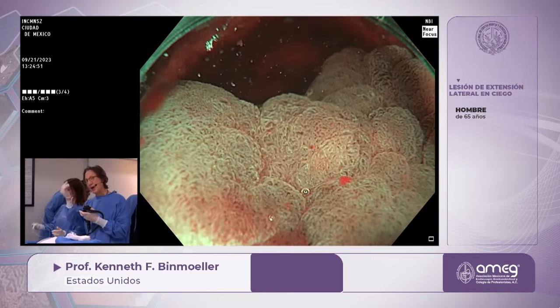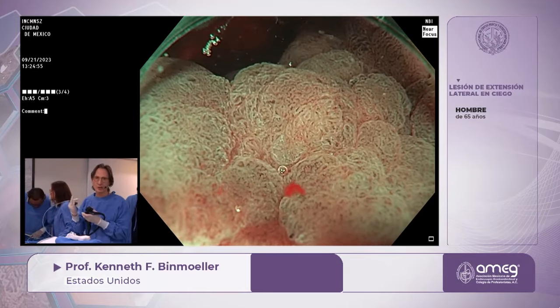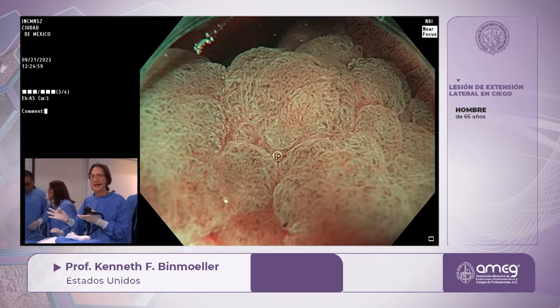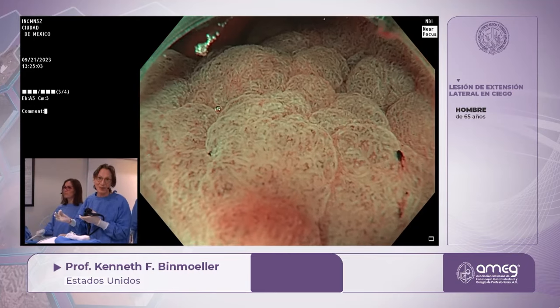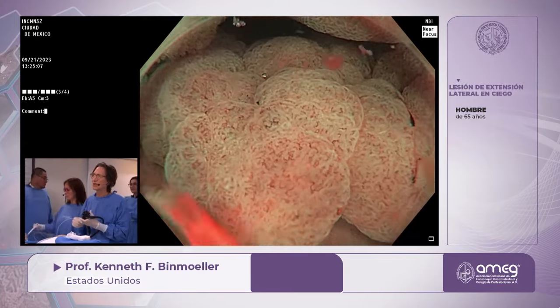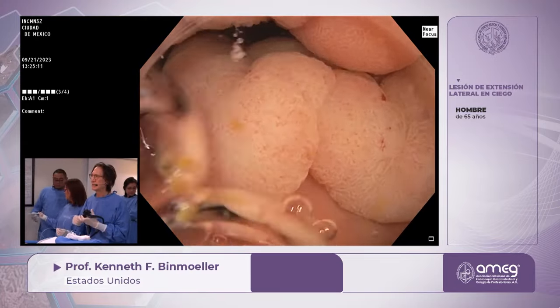So now that we know that this is a lesion that does not show any characteristics or features of invasive cancer, because you don't want to try to resect a lesion that is invasive cancer. That would be a waste of your time. So we don't see any of those features. Let's take off the NBI now. We'll go back to the white light.